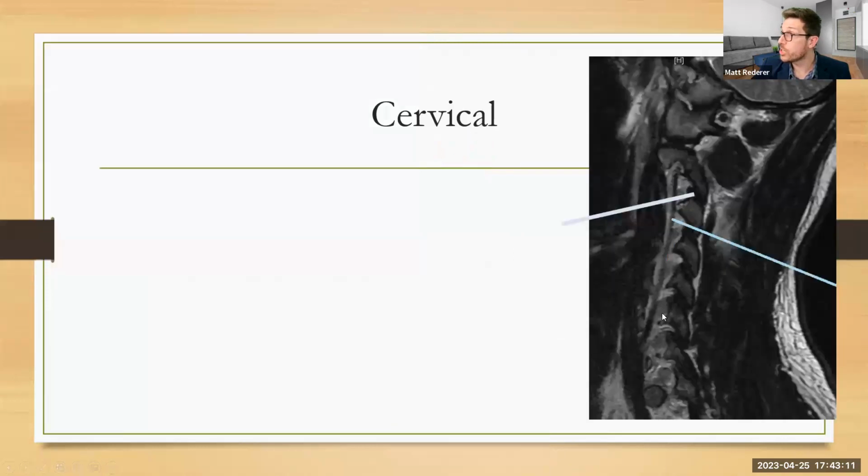All right, this image here is not a mid-sagittal plane. And this is actually, I think, an image of one of the instructors here at the school. I just found that out this week, which I thought was kind of neat. They loaded their own images up here. But in this image, we have to identify some of these structures. This line here is called the vertebral artery. Let me write that down here.